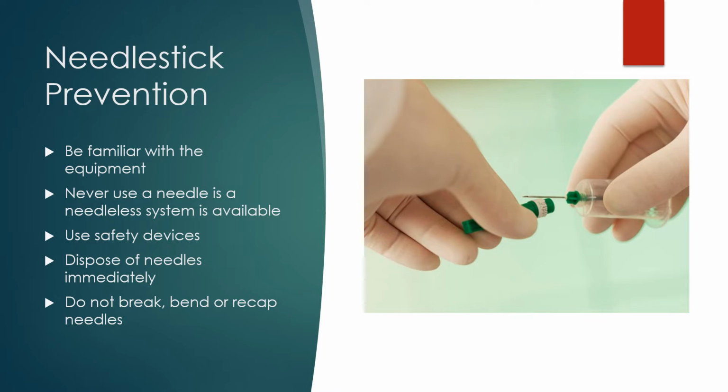Always dispose of our needles when we're done. Sharps containers are in every room, including the patient room, the hallways, the med room. So as soon as you're done with the task, you need to put that needle directly in those sharps containers. Making sure we always use the sharps containers correctly. You drop the needle in, you close it, but sometimes things can get stuck and you want to shove it down in. Never do that. Never stick your fingers down in that sharps container. You will need to dispose of that sharps container and start with a new one if it's too full.